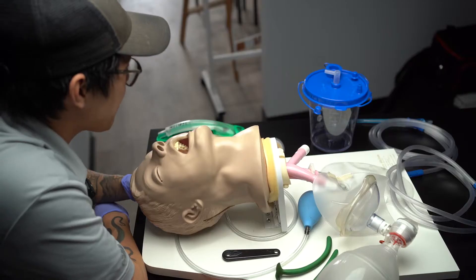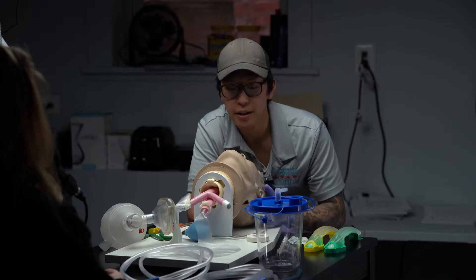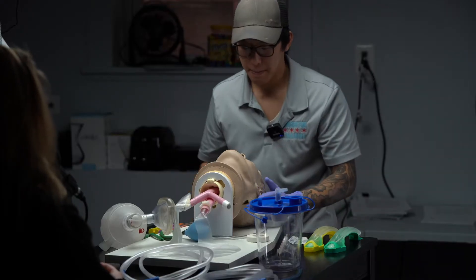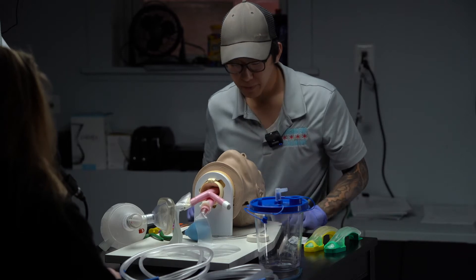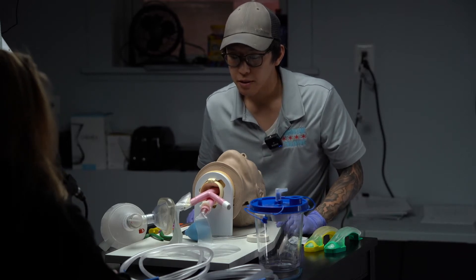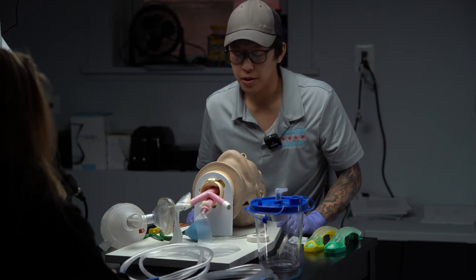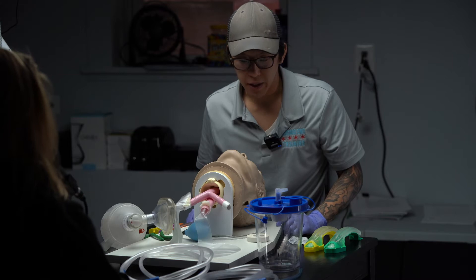Kimberly is going to be my proctor, and this is how it would go on test day. So Kimberly, can you start us off? You're going to be dispatched to an unresponsive patient. Is my scene safe? Your scene is safe. I have my PPE, which includes eye protection, a mask, gloves, and a gown.